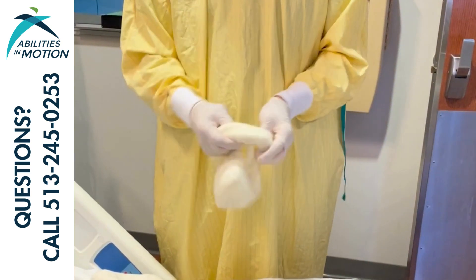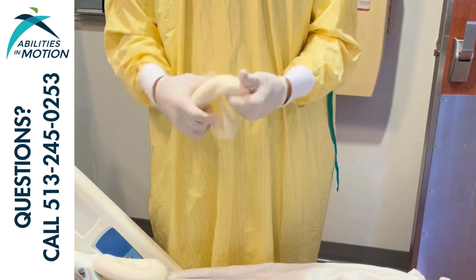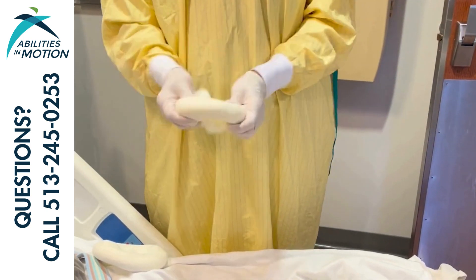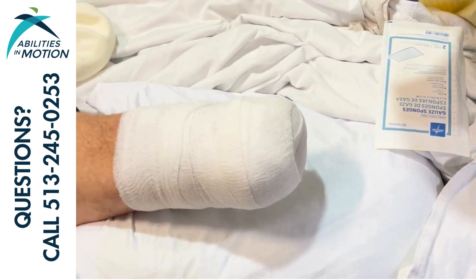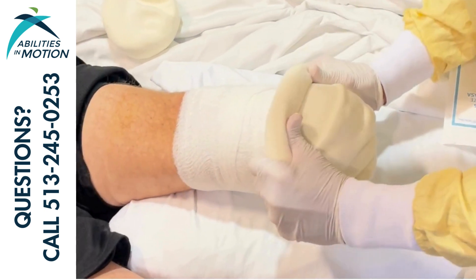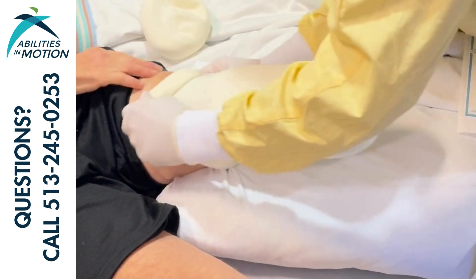After the dressing change has been performed and it's time to reapply the socks back on the limb, it helps to roll the socks up into a kind of donut shape as Tom is demonstrating here. It'll just help prevent the dressing from being as disrupted as we roll the sock up over the limb.